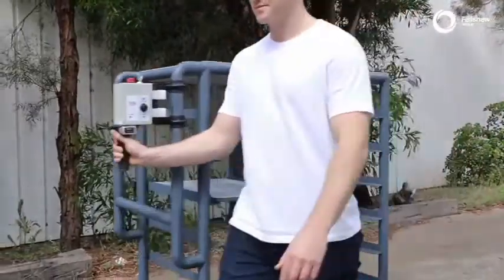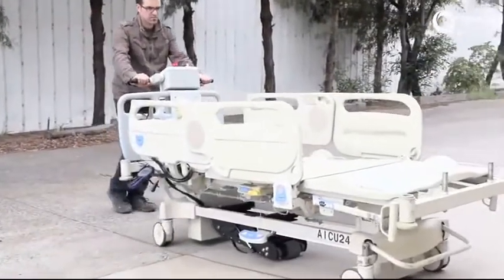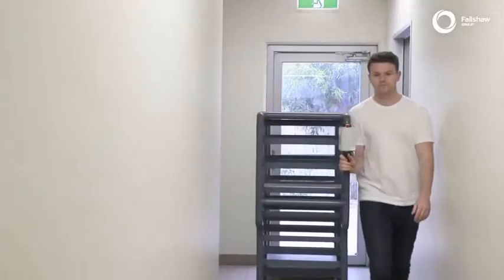The powered fifth wheel is a retrofittable solution for converting your manually pushed trolleys or hospital beds to powered ones. It works with the other four wheels to help move heavy loads safely and efficiently.